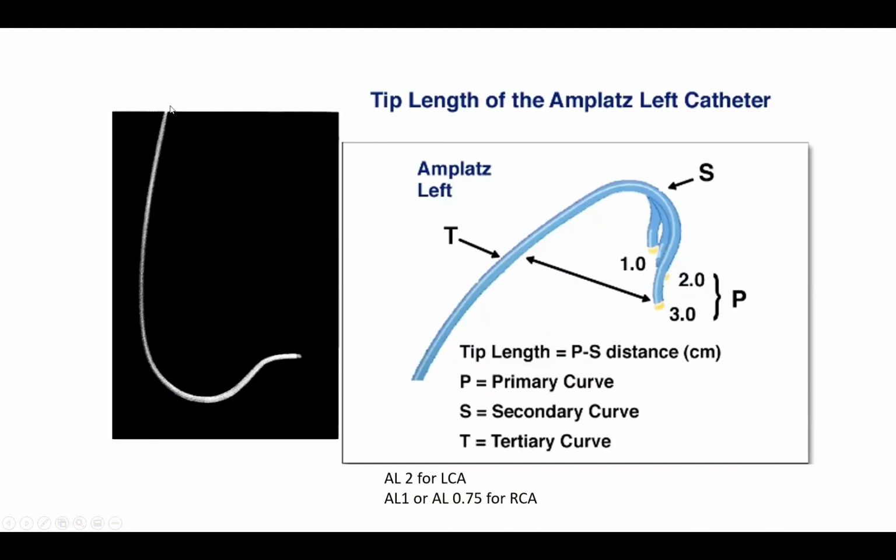One, how is the catheter looking? As I described, it's a catheter that is duck-shaped with a big butt that sits on the aortic valve and the opposite aorta. That's what makes it so special, that support it gets from the aortic valve and the opposite aortic wall.